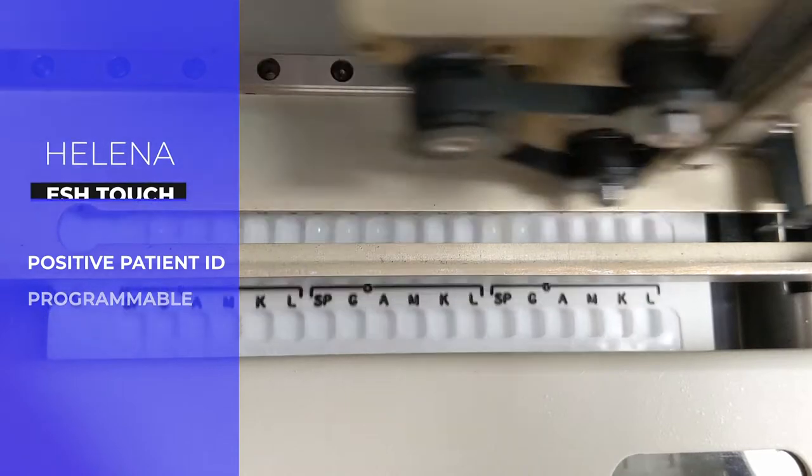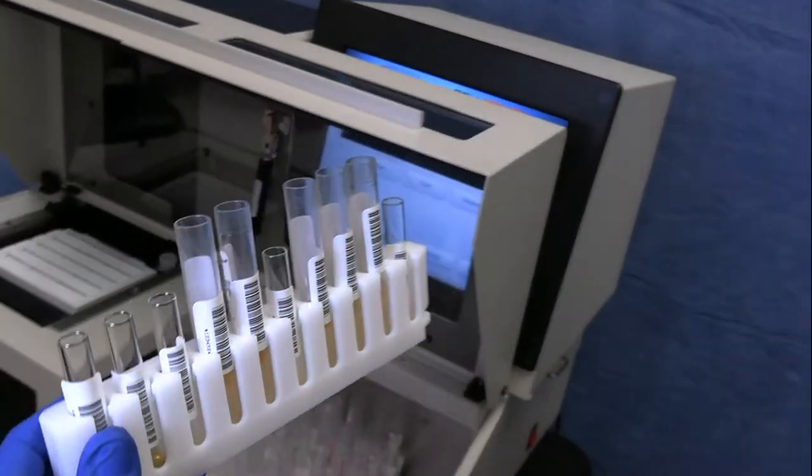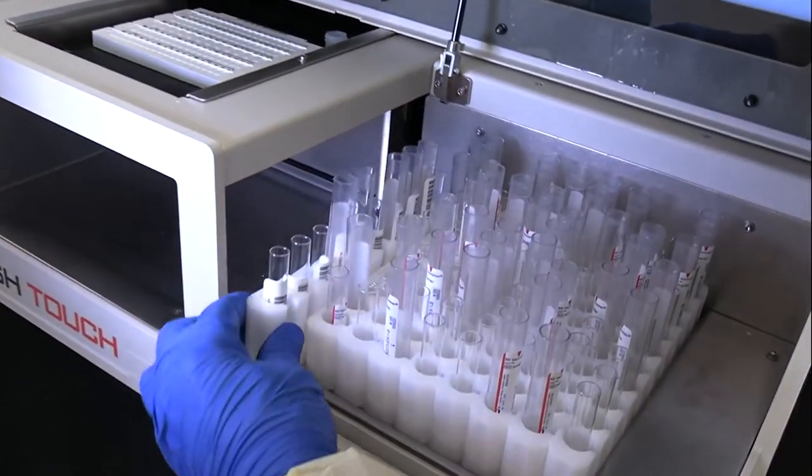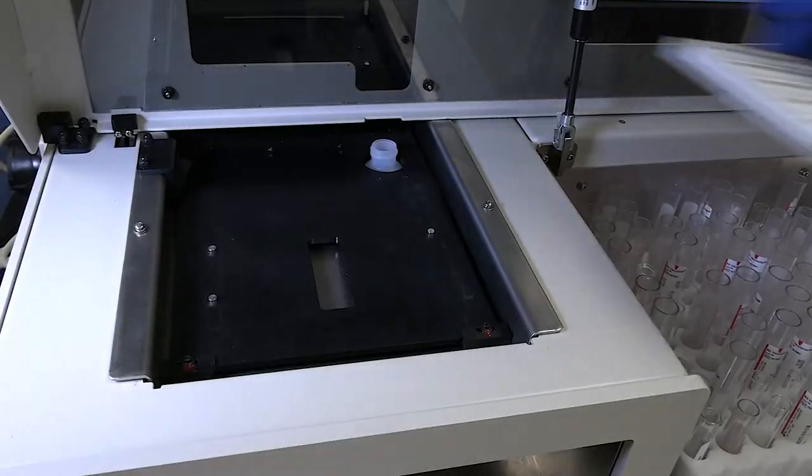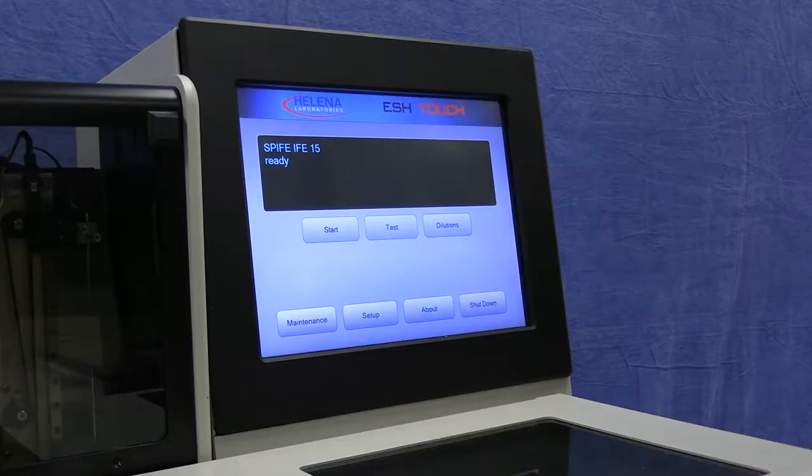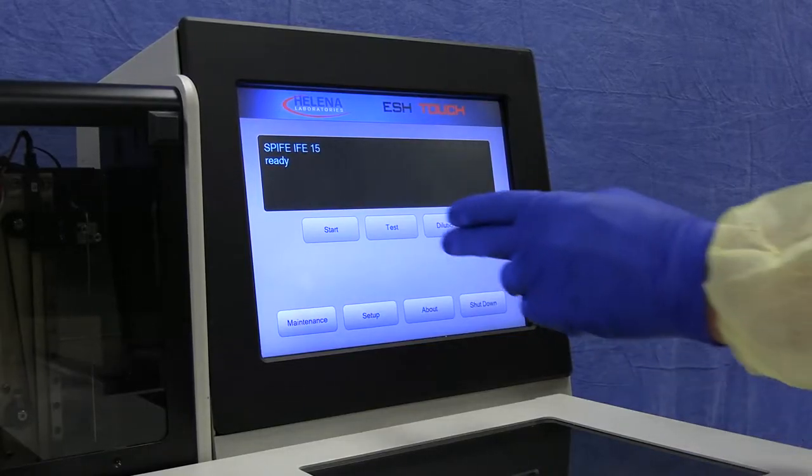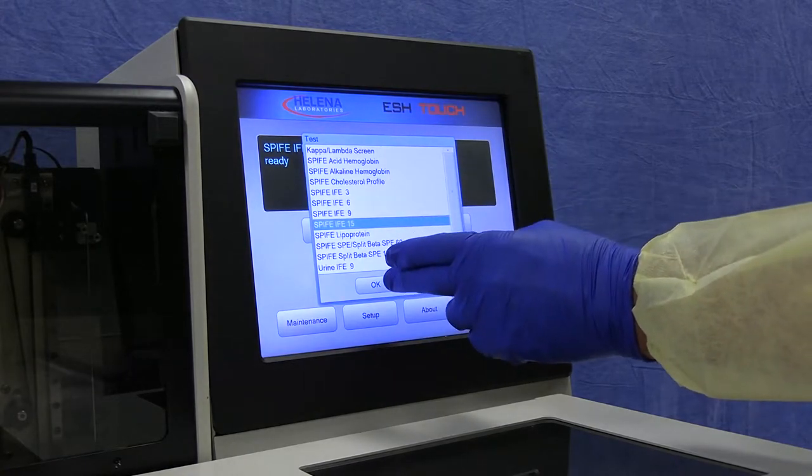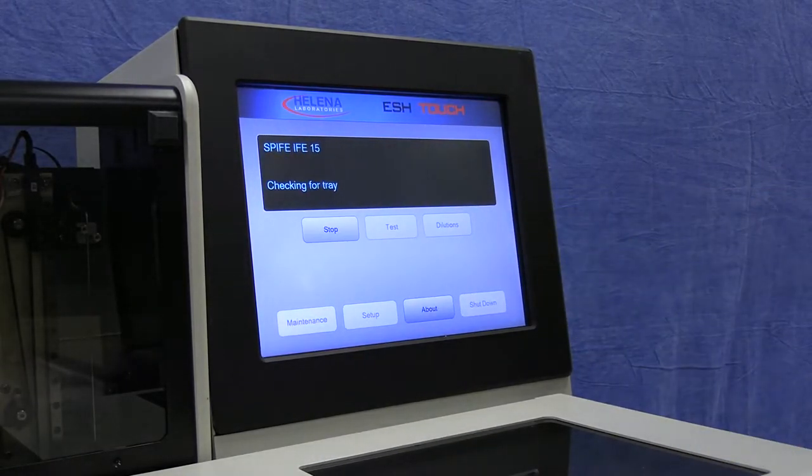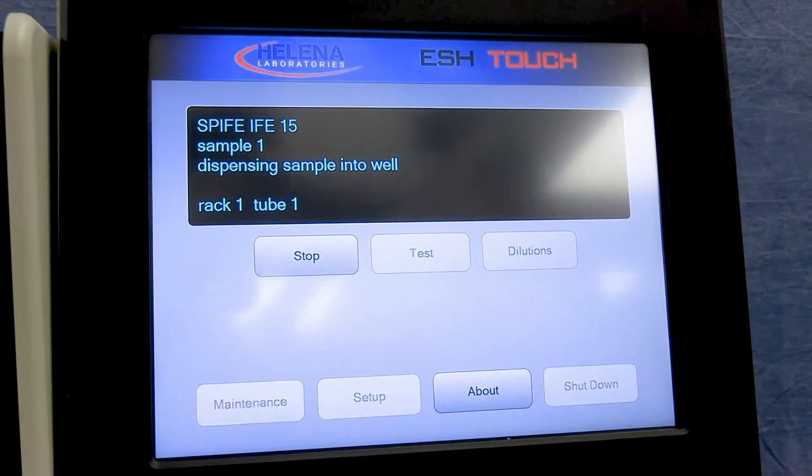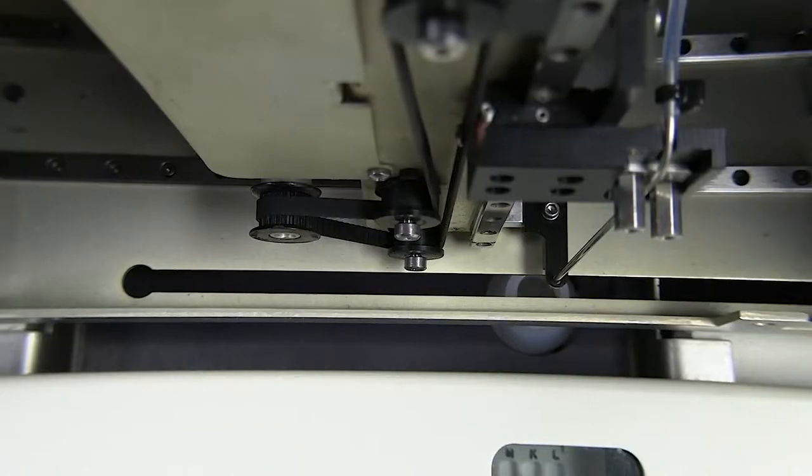To operate, place racks into the instrument, install a sample tray, select the test, and push start. The ESH Touch takes over and does all the work, preparing patient samples in less than 25 minutes. Up to 100 SPE samples can be processed.